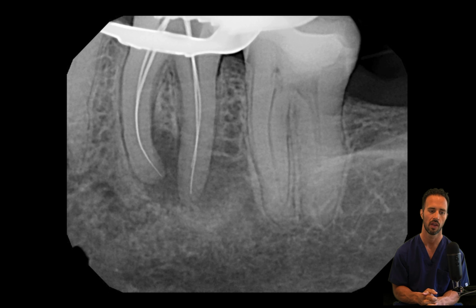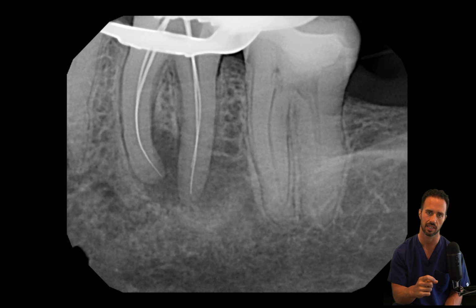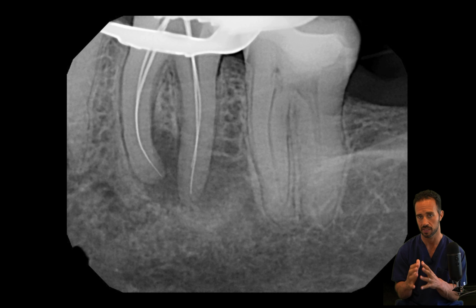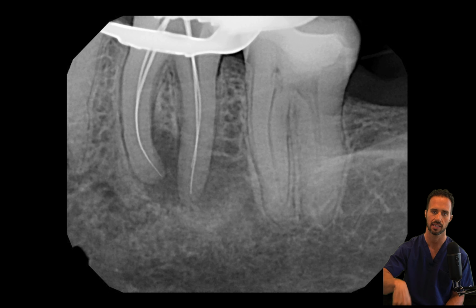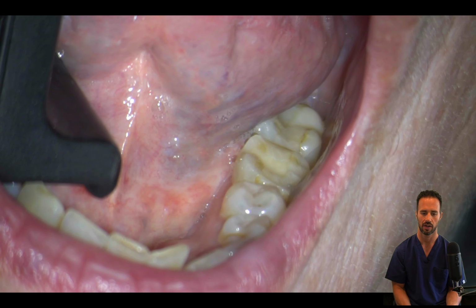Once we get back into the core of the tooth, I'm just going to use that same size rotary file, not the same exact one, and just pass it through the 4 canals and then go into our disinfection and our obturation phase. So this is a pretty time-efficient appointment, and it's chit-chat and maybe 10 minutes of clinical work. But anyways, let's get right into it.